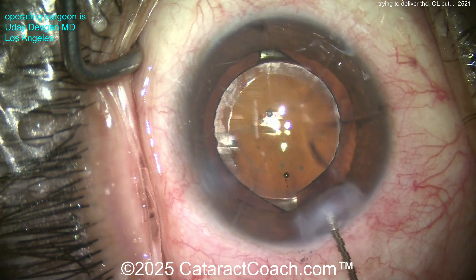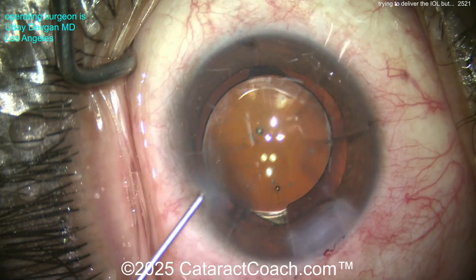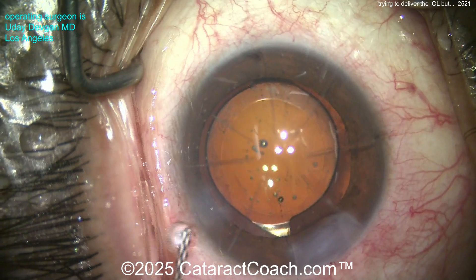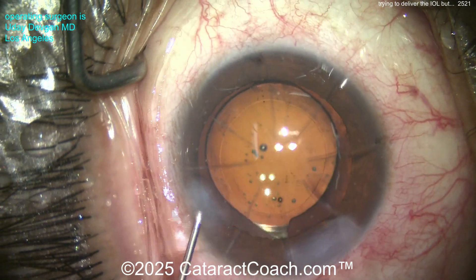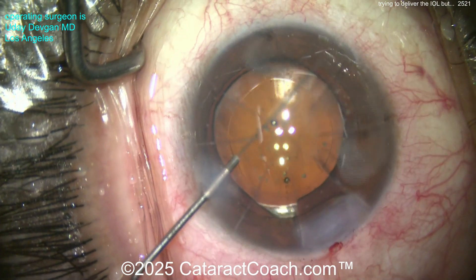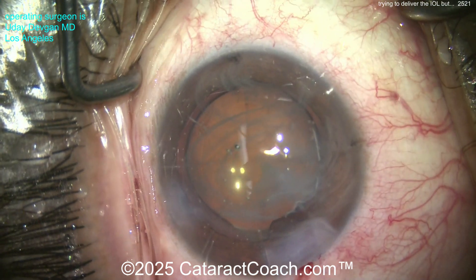At the end, gentle, minimal hydration — don't overdo it. Get the eye back to physiologic pressure and make sure there's no more retained viscoelastic. That looks good, and the toric lens is in the correct orientation.